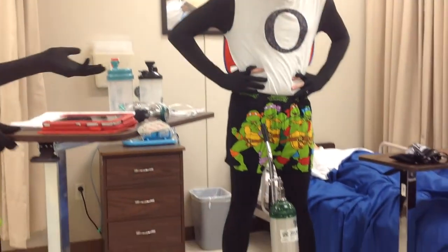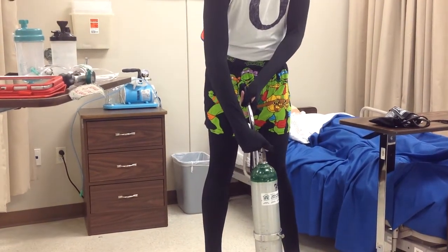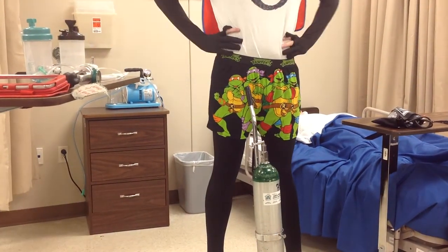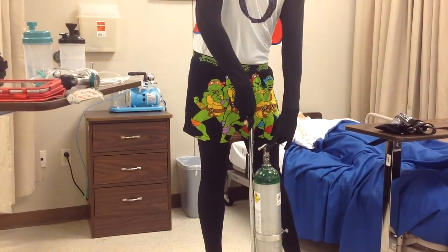First, you'll take your MAR and go into the oxygen room. You're going to check the stand first, because you don't want it falling over. You don't know how long the oxygen's been sitting there, so you want to crack the tank and blow some air out. The reason is to get any dust or anything that may be stuck in the little hole when you attach it to your regulator.